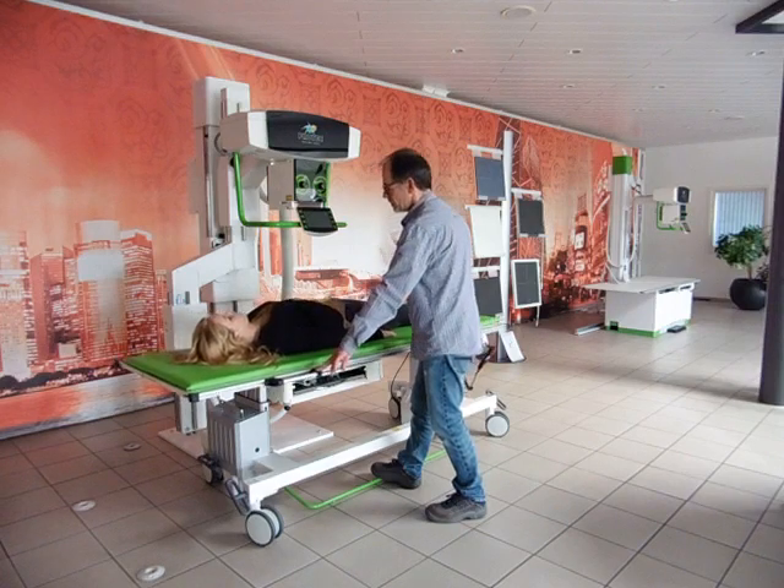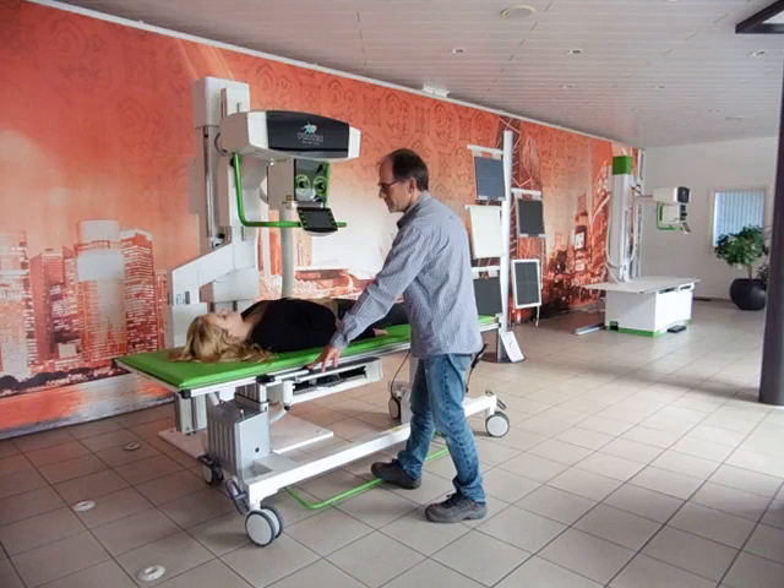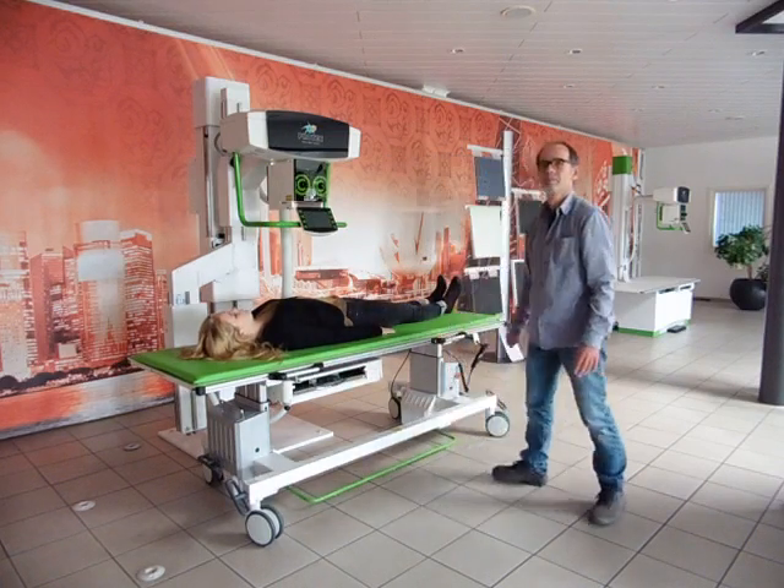You can also use the floating table top and move the table over the bucky. That's it.